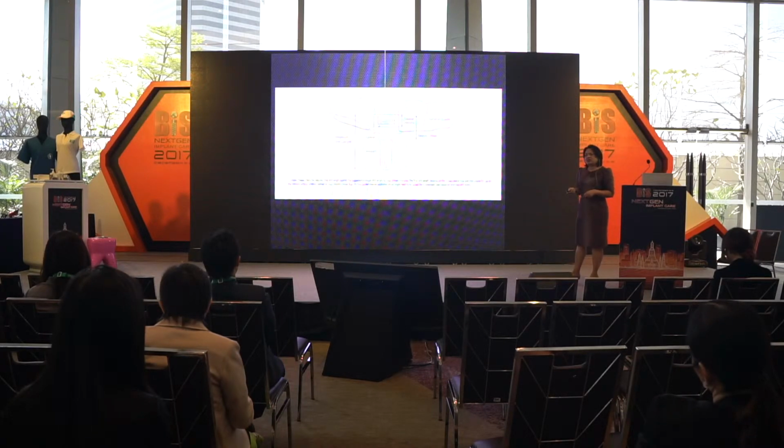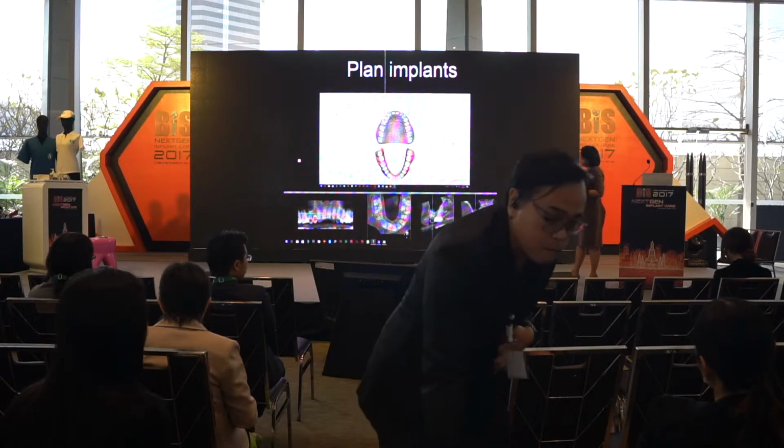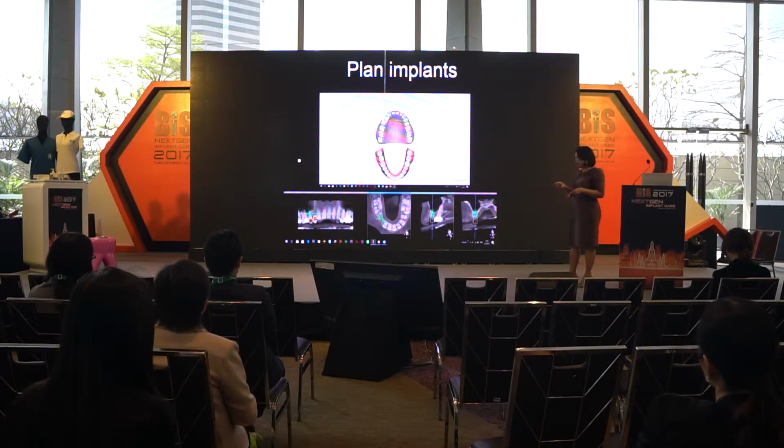When we use guided surgery in the posterior position, we need to be concerned about the mouth opening of the patient. In some cases, we cannot use that. For planning the implant, you need to know where the bone and the soft tissue are, and where you place the implant, and whether it is parallel or you need an additional or further procedure, like a sinus lift or bone graft, simultaneous bone graft or not.